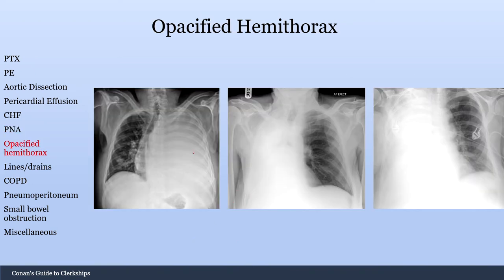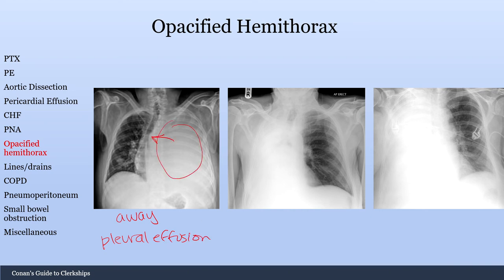Next, let's talk about an opacified hemithorax — where the whole half of the thorax is whited out. The main way to narrow your differential is based on tracheal deviation. Here the trachea is deviating away from the opacified hemithorax — the differential for that would be a massive pleural effusion, because so much fluid is pushing the trachea to the other side.